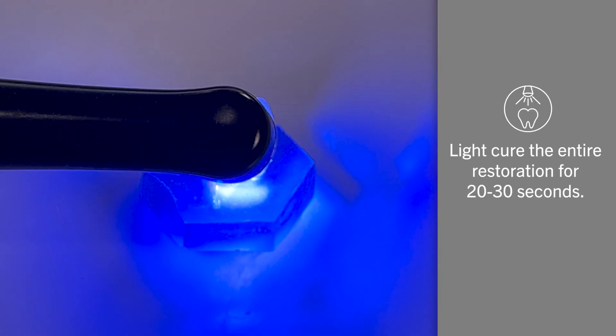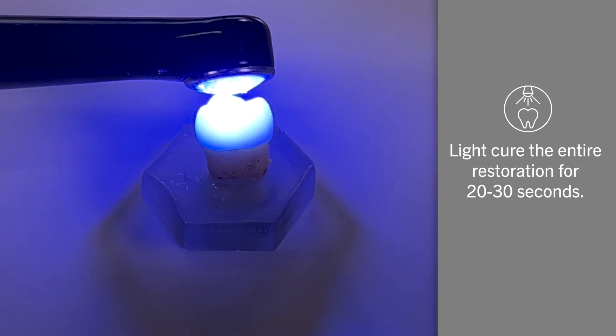To finish, light cure the entire restoration for 20-30 seconds, or allow it to self-cure.